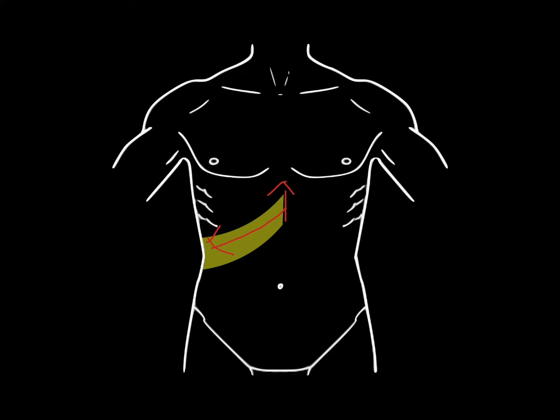And so I like to bring the probe along the costal margin towards the patient's right, towards the mid-axillary line, and look at the liver, the gallbladder, and all those structures as I pass through there, make sure that they all have the same echogenicity that they should, that there's no masses, no hypoechoic lesions or hyperechoic lesions. That also lets me know how easy it's going to be to look at the gallbladder.